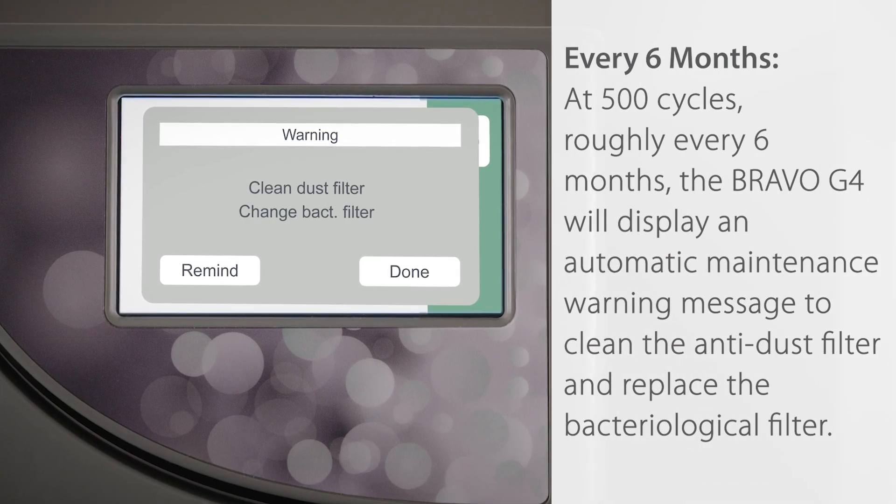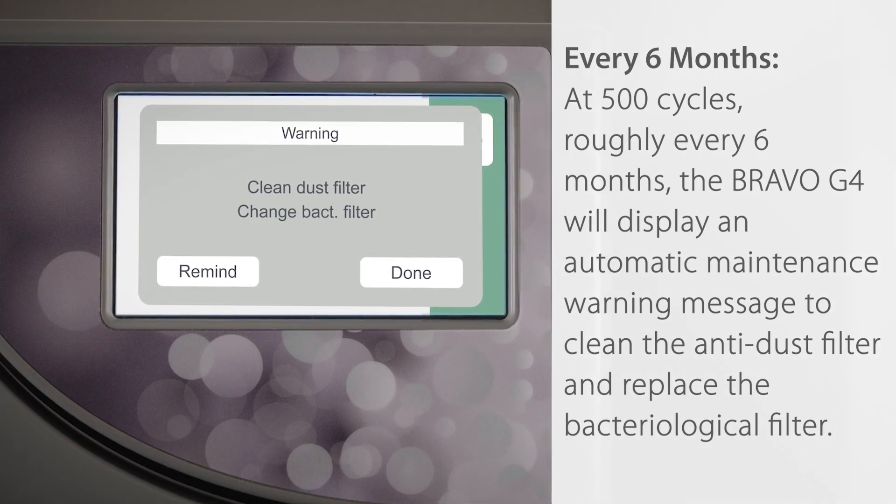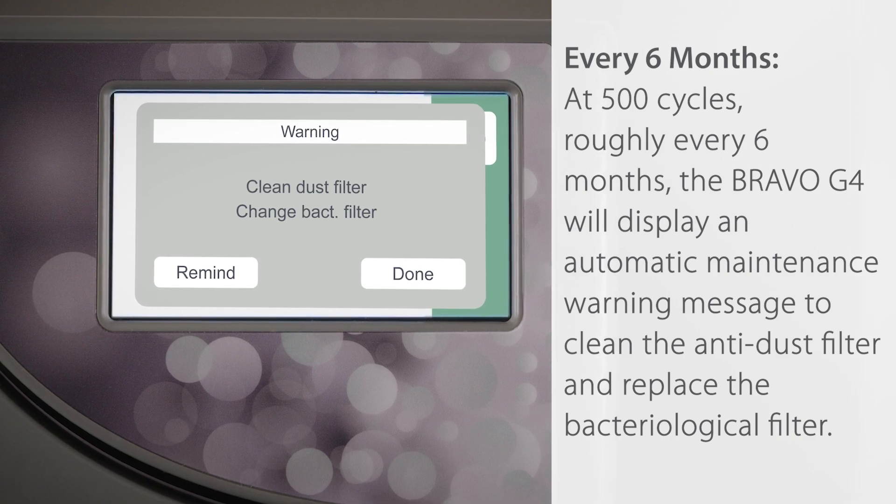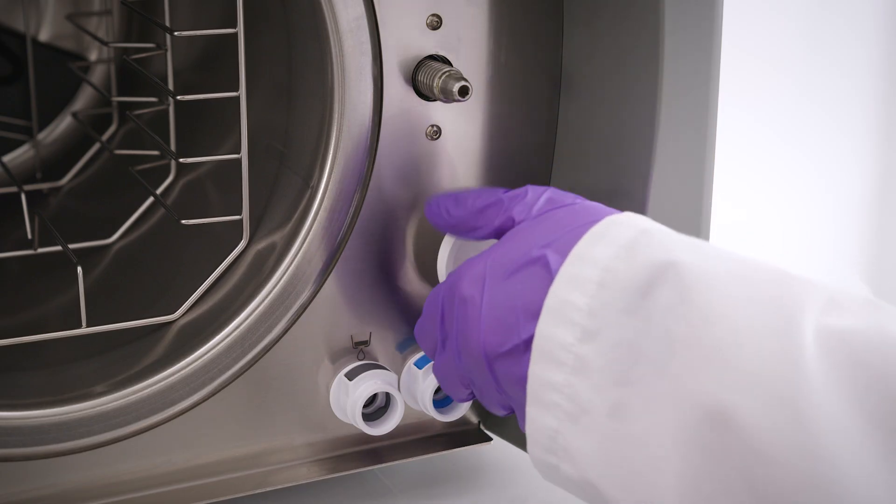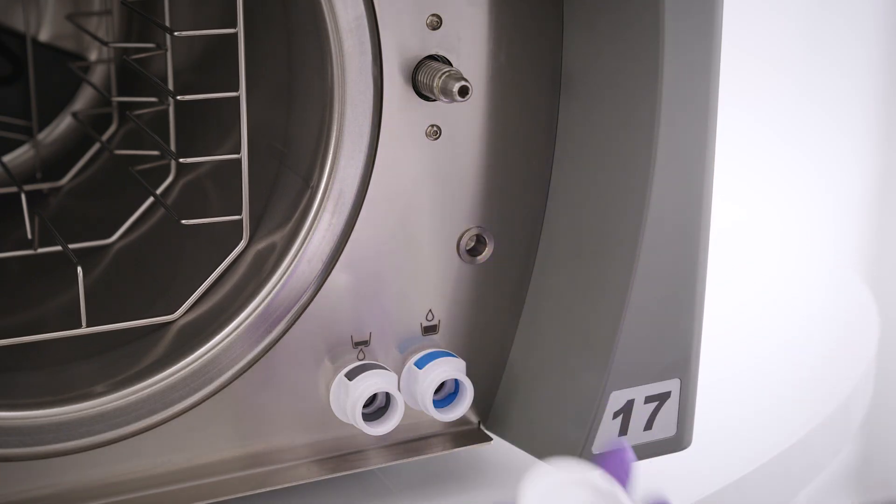Every six months, at 500 cycles, roughly every six months, the Bravo G4 will display an automatic maintenance warning message to clean the anti-dust filter and replace the bacteriological filter.